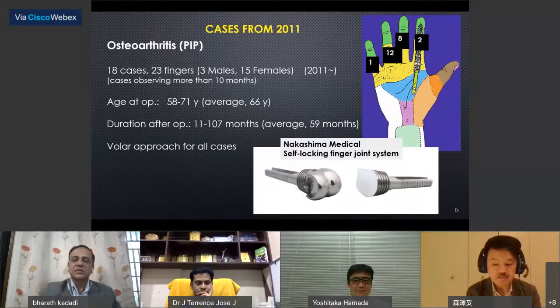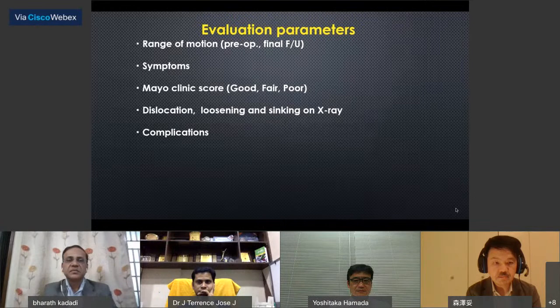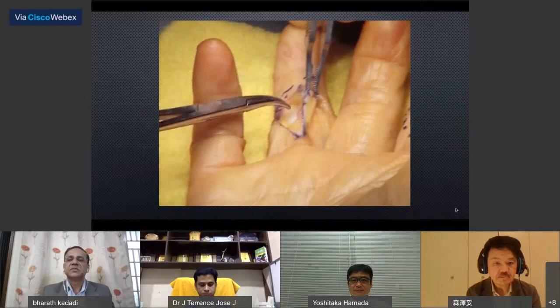The evaluation parameters include joint range of motion, both pre-operative and at final follow-up, symptoms, the Mayo Clinic score, 3 grades, dislocation, loosening, and sinking from X-ray, and complications. In operation, volar zigzag incision and protect digital nerves.